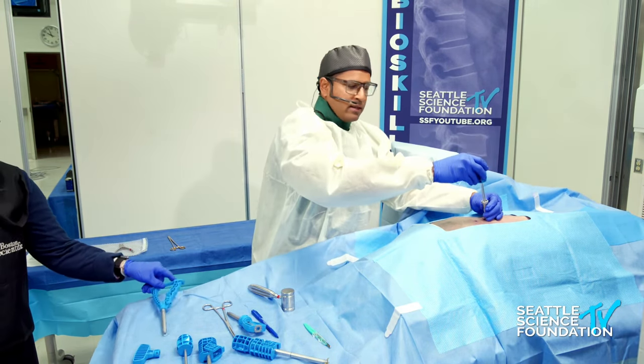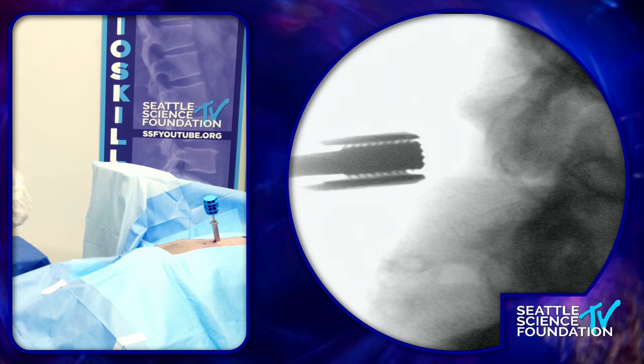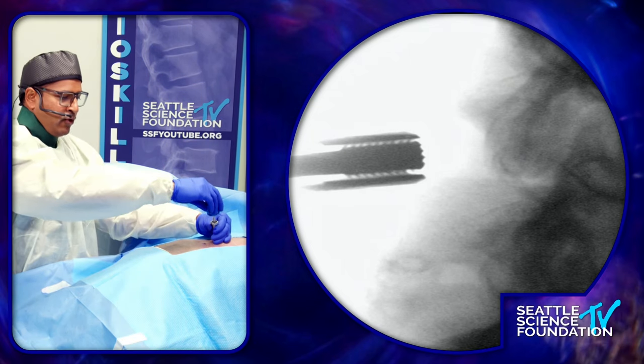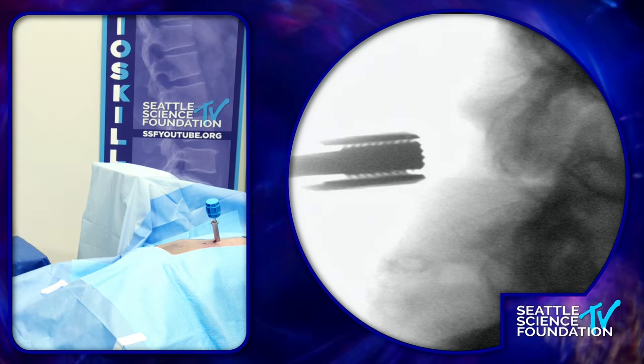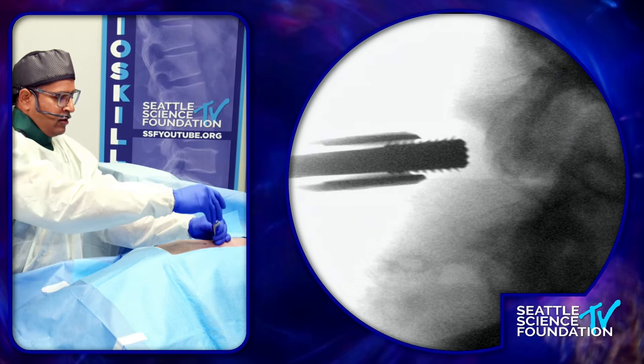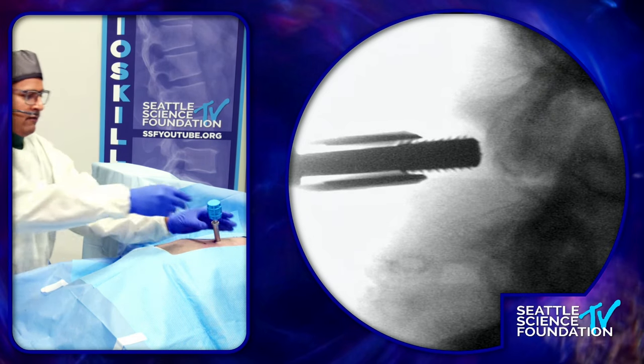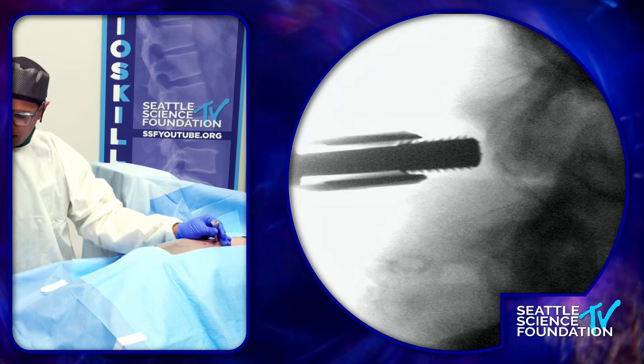The next step through that working channel is now the game of thrones weapon called the reamer — some people call it the pineapple; I like that. We drop that in and get it to the spinal laminar line. You're going to see the pineapple clearing out the soft tissue. I'll take it a little bit further to that spinal laminar line — perfect. Then we take that out and measure.